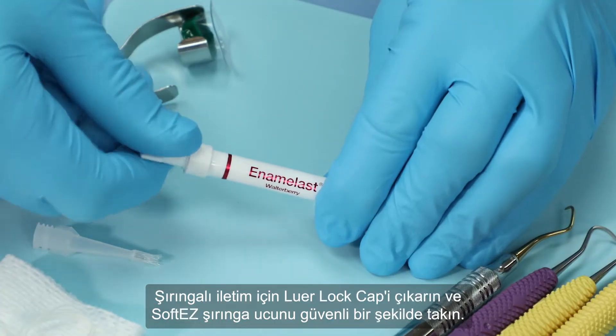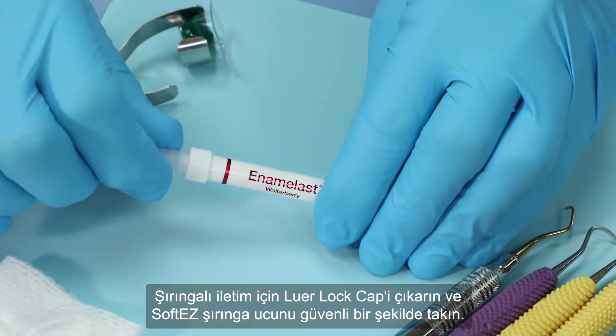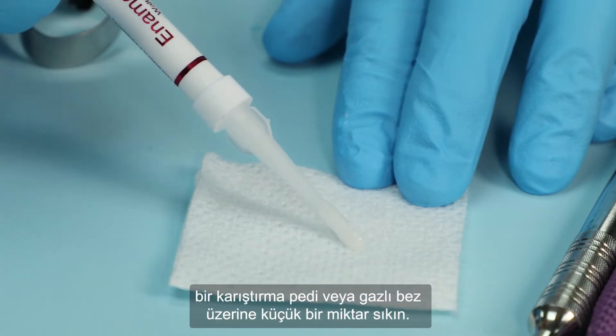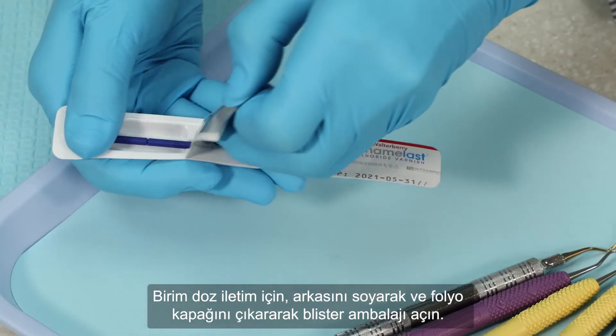For syringe delivery, remove the Luer lock cap from the syringe and securely attach the SoftEasy delivery tip. Verify color, consistency, and flow of the product before applying by expressing a small amount onto a mixing pad or gauze.